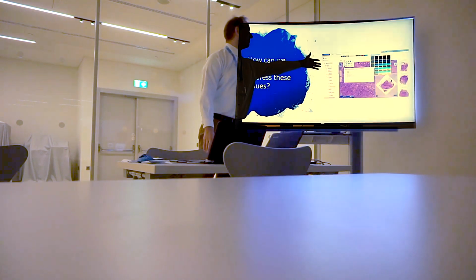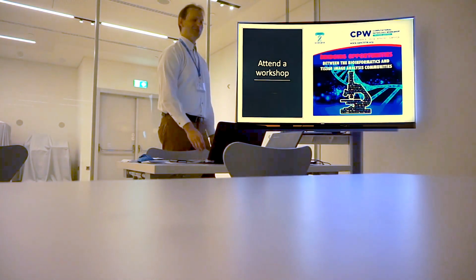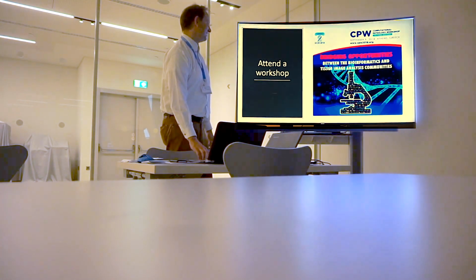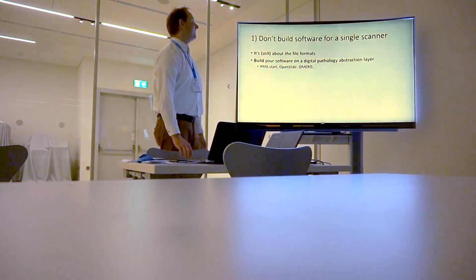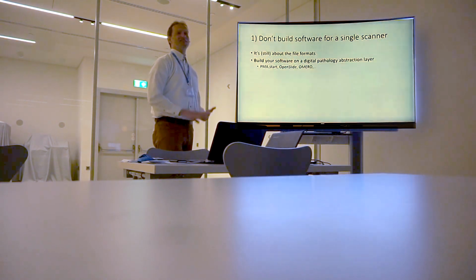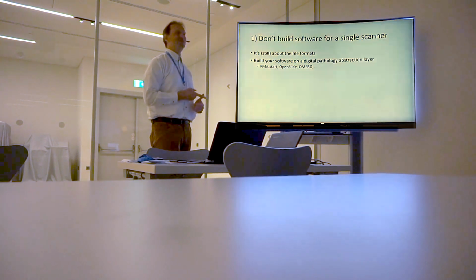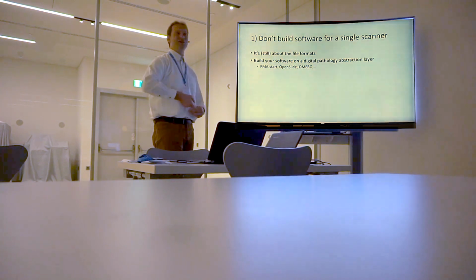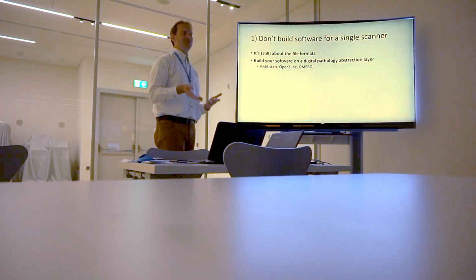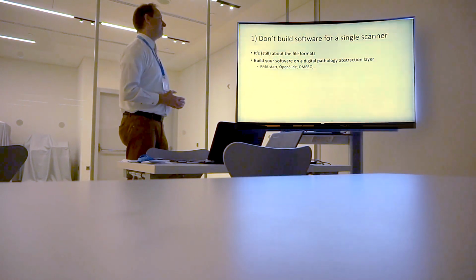By making super duper user-friendly software, of course, but also attend a workshop. So I would say, okay, check. But there's a couple of things. There's 3 takeaway messages that I would like to give you, and that's first, don't build software for a single scanner. It's still very much about the file formats. You need to get to the pixels, as Jeroen puts it very simply.